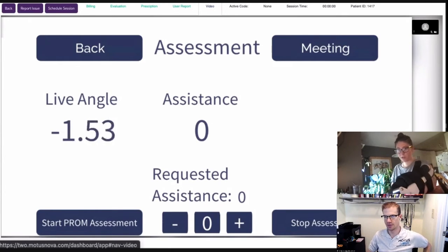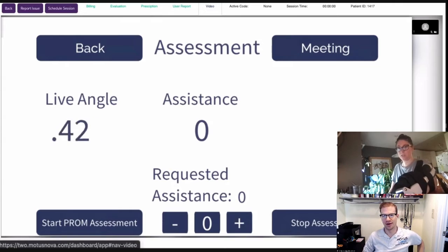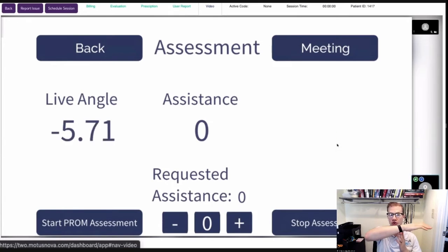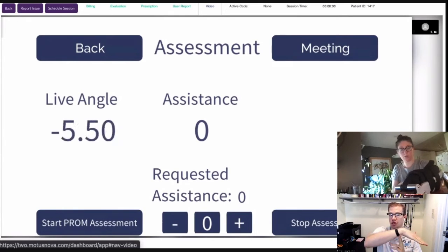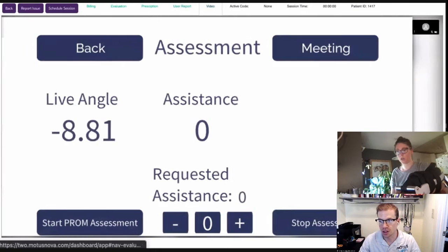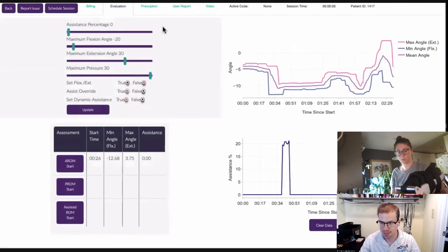I don't feel like my flexion ever does anything. Yeah, well, Catherine, it's really interesting. If you're looking at the data on the screen, whenever you move down into flexion, those numbers are going to become more and more negative. Whenever you move up into extension, whenever you cross 0, which is kind of neutral, that's going to be extension. Okay. So let's try to do it one more time.